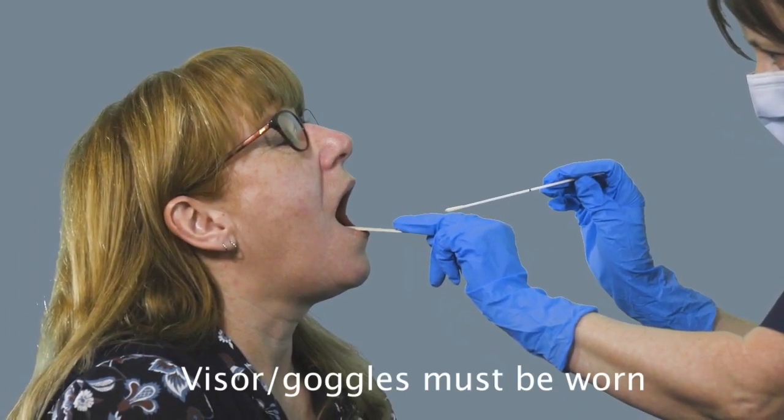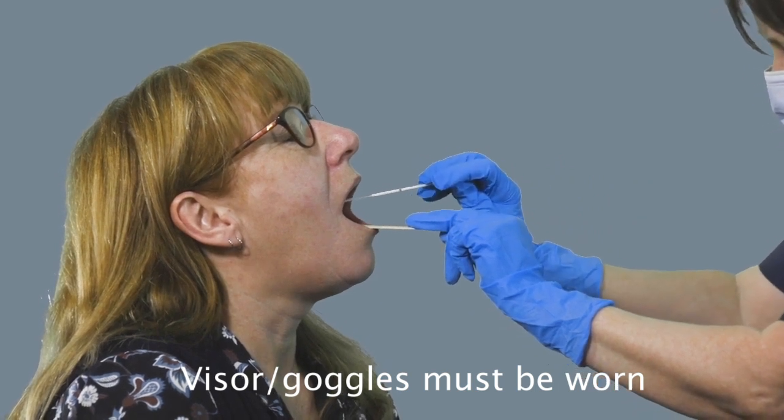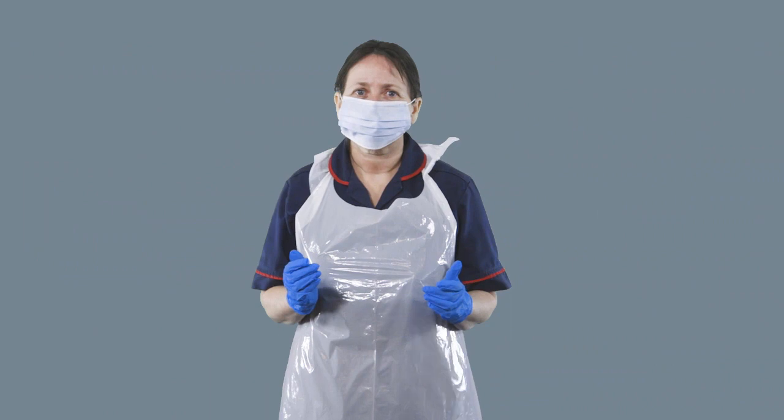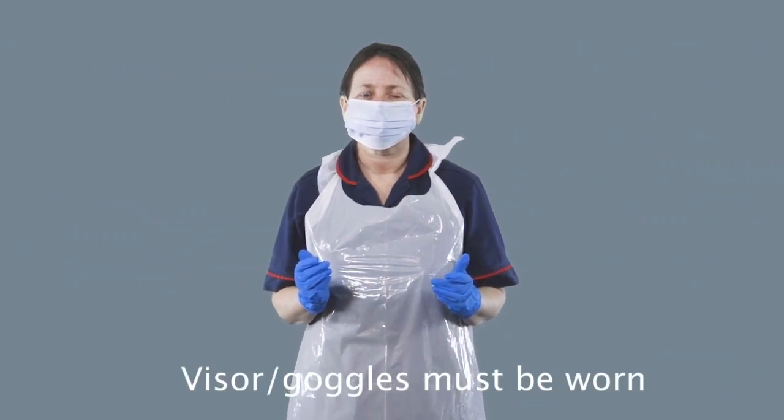Hello everyone. Today we're going to talk to you about how to take a viral throat swab. We're going to tell you how to do your personal protective equipment for that swab.